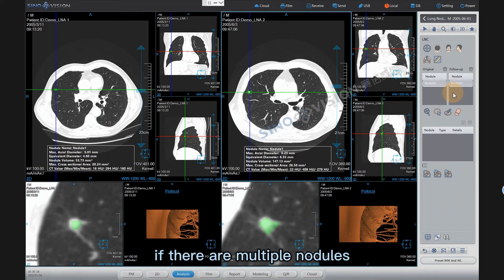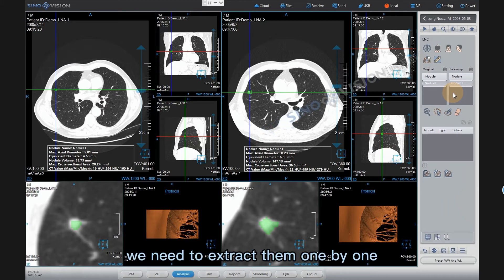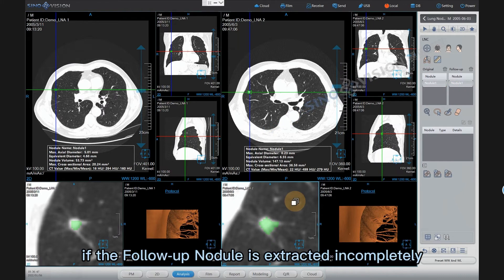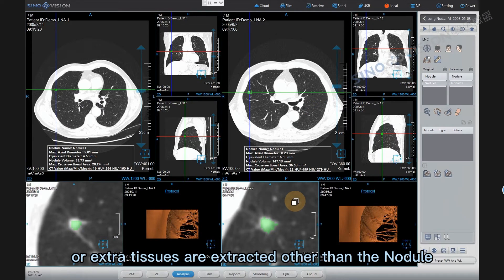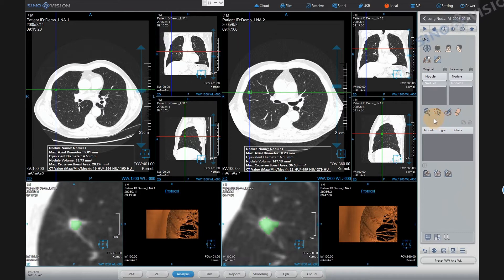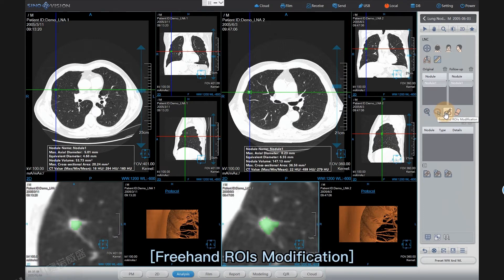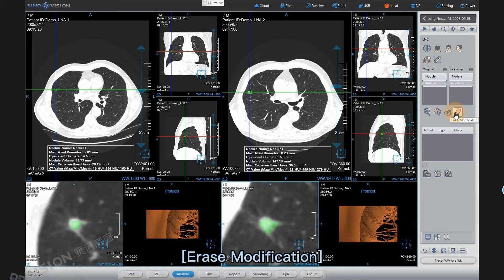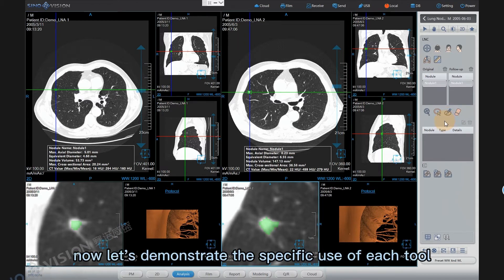If there are multiple nodules, we need to extract them one by one. If the follow-up nodule is extracted incompletely, or extra tissues are extracted other than the nodule, we can modify the extracted nodules through the nodule editing tools, including: VOI modification, Magnetic ROIS modification, Freehand ROIS modification, and Erase modification.